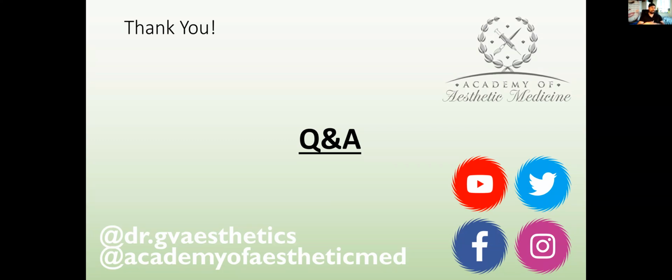Sherelle from Nottingham, I'm guessing, asks what my products of choice are for the mid-face. Recently I have been using quite a lot of the Luminera range, and they've got a product called Ultra Deep, which has 1.25 mil in the syringe. So you've got a lot more to play with there, and you can effectively do both sides of the face, especially when focusing on the periorbital region, because you do want a very deep product. But yes, for mid-face, you want something with a very high G prime.